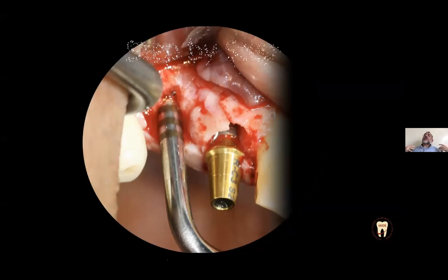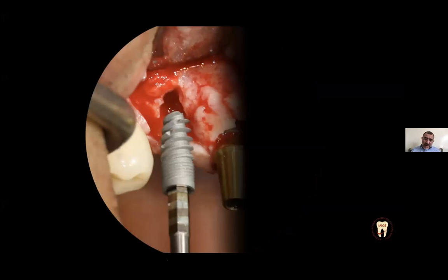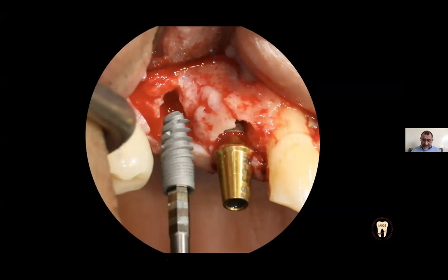If you don't perforate your Schneiderian membrane, you can continue to put PRF and CGF and eventually the bone grafting into the sinus, and you put your implant in the same stage.